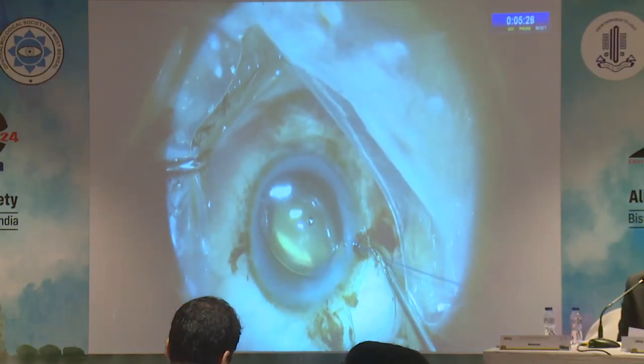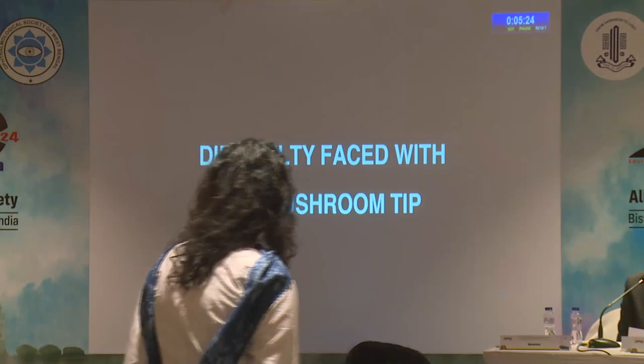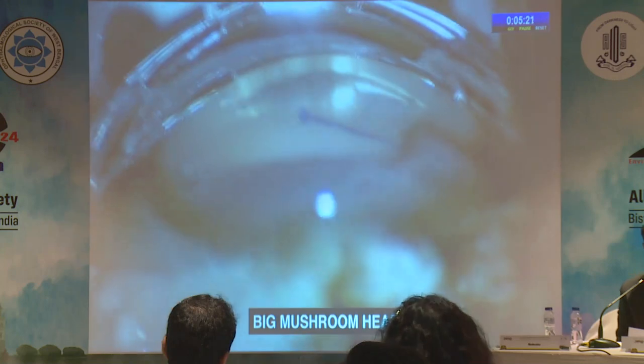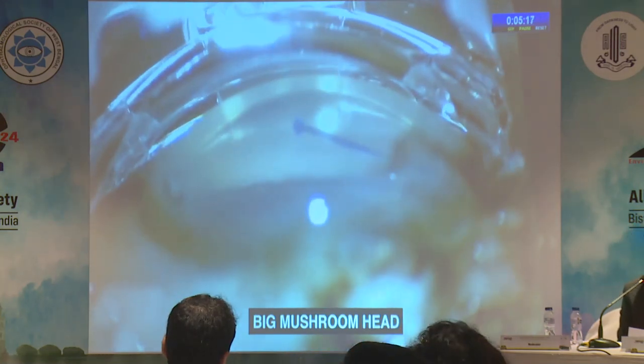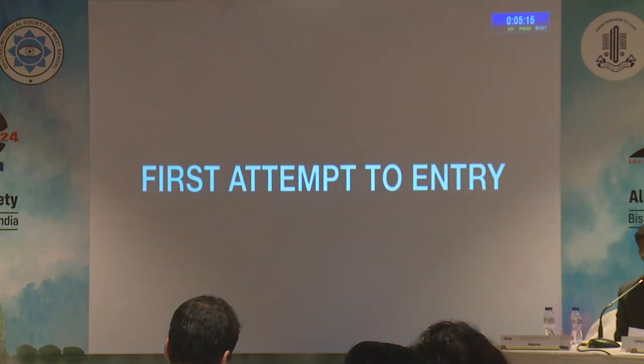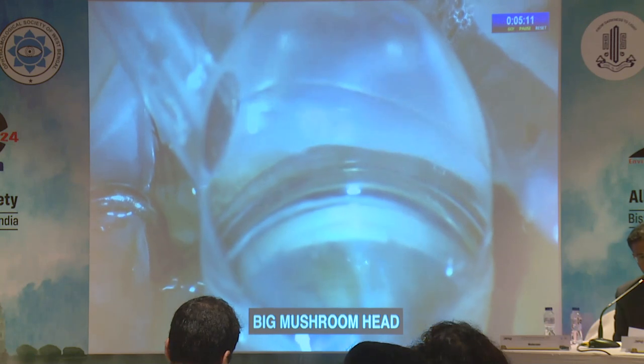The suture is introduced into the anterior chamber with the blunt end mushroom tip. Difficulty faced with a big mushroom tip: a bigger mushroom tip hinders its entry into the Schlemm canal. Video showing the failed attempts with a bigger mushroom tip to enter the Schlemm canal.